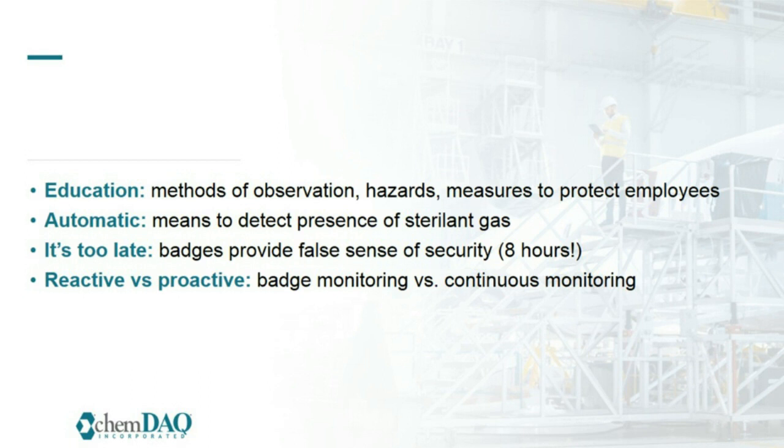Automatic, it's meant to detect the presence of sterilant gas automatically. So sterilant chemicals used to sterilize temperature-sensitive medical devices are imperceptible to human senses until concentrations well above the dangerous level. And these are often not quantifiable by smell. So is it too late?